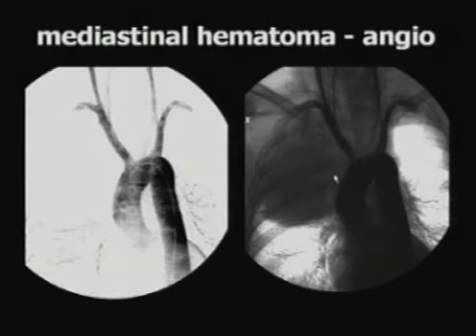So in that instance, of course, we TURF. So TURF the patient to angio, which was still probably the next best move, but we can see that this right extrapleural collection has now expanded again in size. And they found no aortic injury nor any other actively bleeding vessel. And our angiographers came in within probably 2 or 3 hours from the time that we started. I this time was frantically going over 3Ds, MPRs, and trying to figure out what was going on.